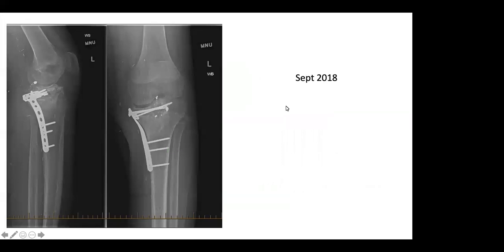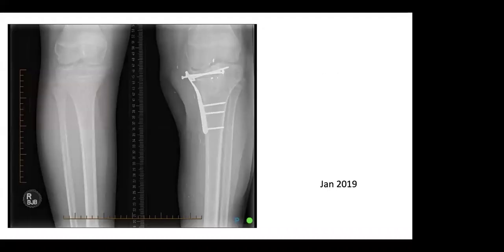So we can see a fairly depressed medial tibial plateau with a small plate on that is not really holding the articular surface as the femoral condyle falls into this defect. Any comments anybody wants to make? This is not the real problem at this time, but why don't we just move forward so we can get to the problem.